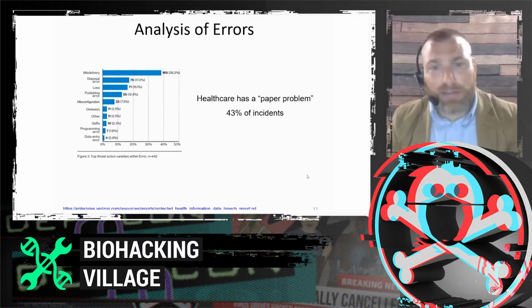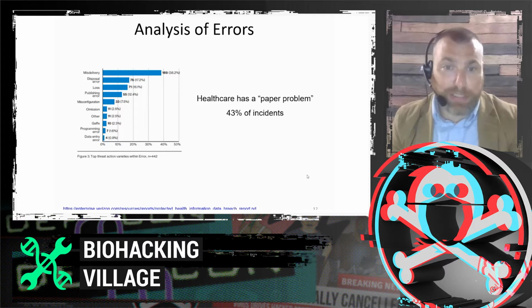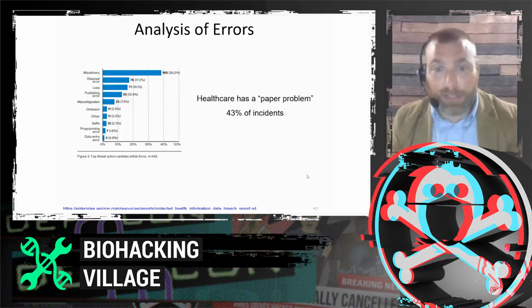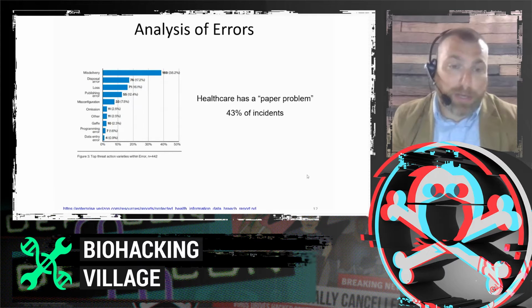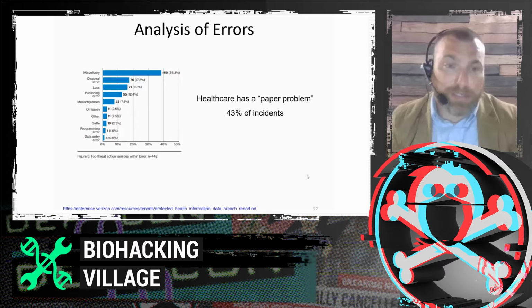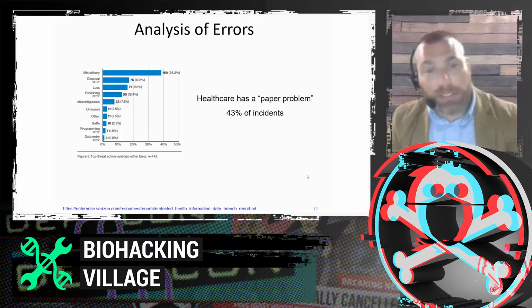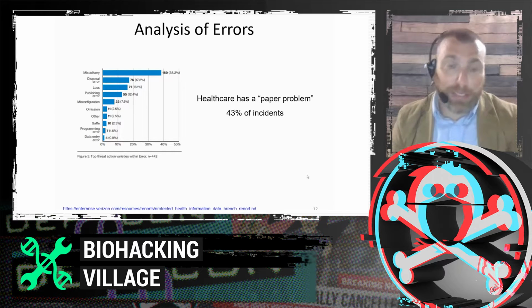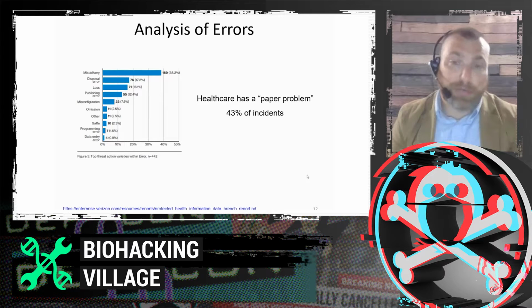So if we dive down into those errors, again, over 30%, misdelivery was the biggest. So, sending PHI somewhere where it wasn't intended to go. Disposal error, so we think we've properly cleared a device, or this could be paper records as well. Loss, we just lost the data, we didn't know where it went. Publishing error typically would be like a study. So we've released a study that we think had anonymized data. That data was able to be de-anonymized, and it basically resulted in a data breach.